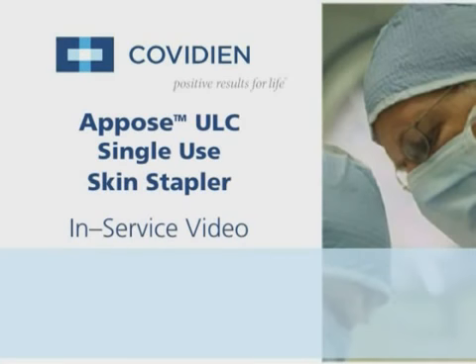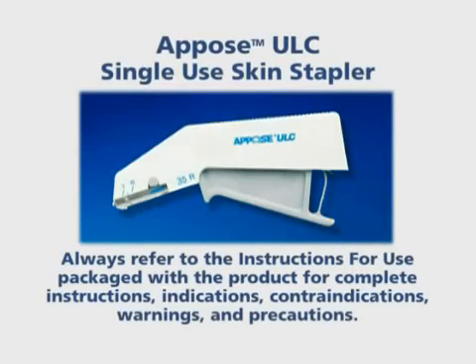This in-service video will provide you with basic instructions on using the Appose ULC single-use skin stapler from Covidien. Always refer to the instructions for use packaged with the product for complete instructions, indications, contraindications, warnings, and precautions.